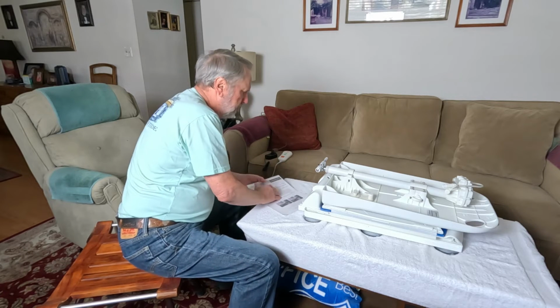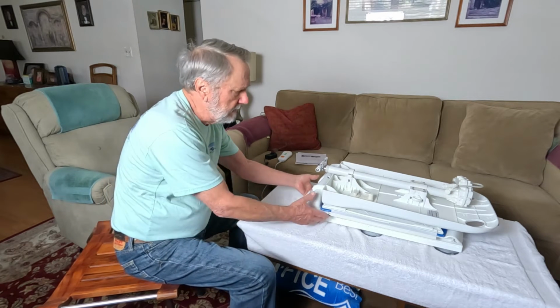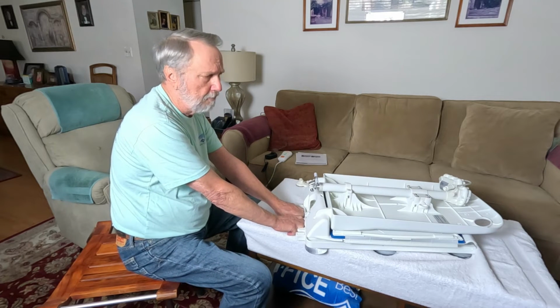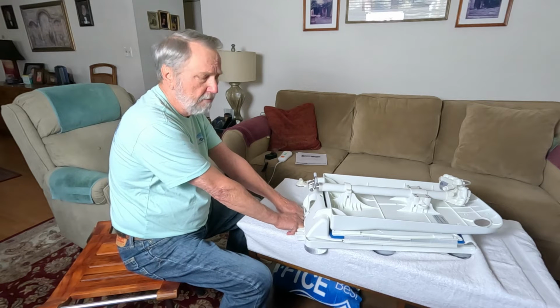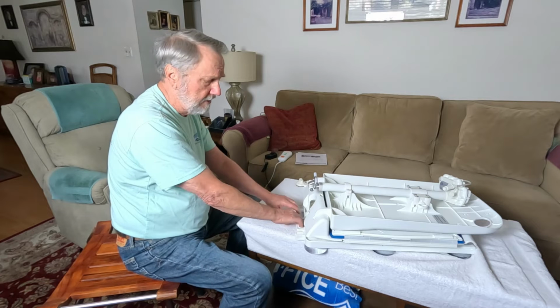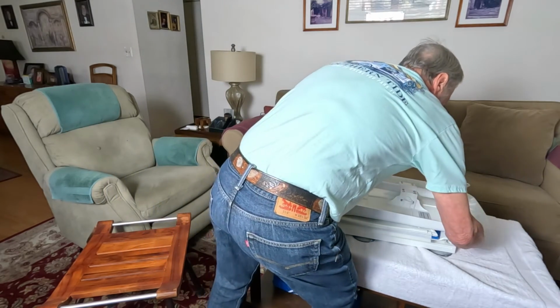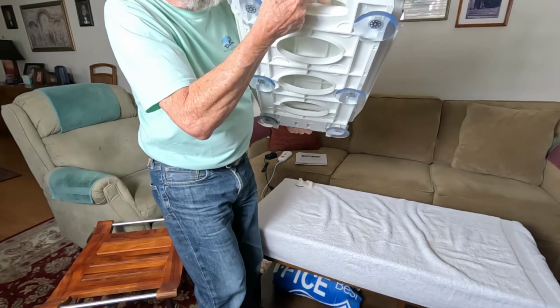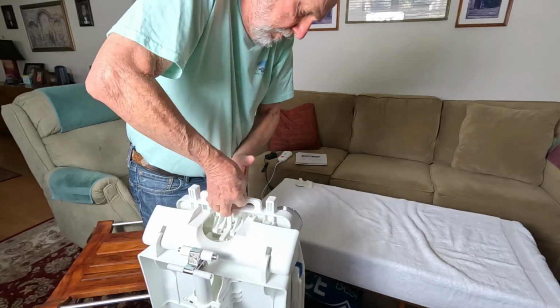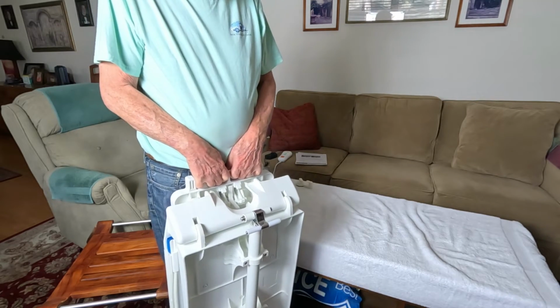Now, let's look at the chair itself. It weighs 30 pounds, and it has a handle on this end. Let's put this over to the side. This handle, if a person has trouble lifting 30 pounds, you could hold it with both hands to pick it up. There's another handle on the other side, so if two people want, they could grab this and take it to the person that has fallen. Now, the way you normally carry it is from this end, like this. And like I say, you can hold it with two hands if you need.